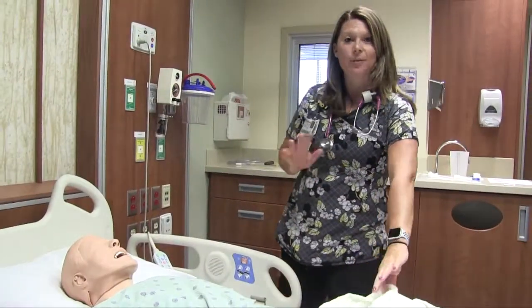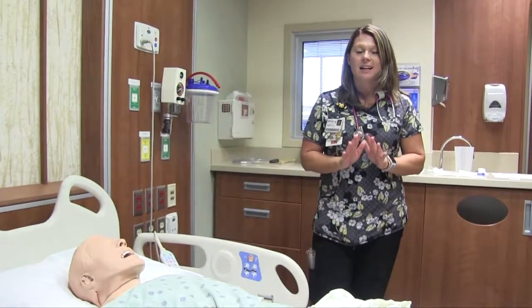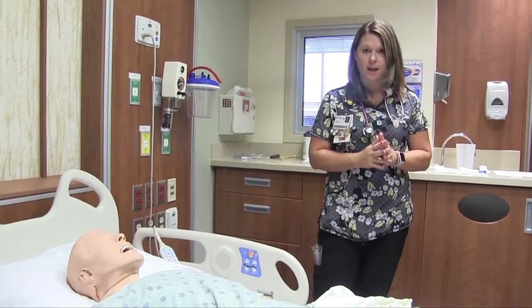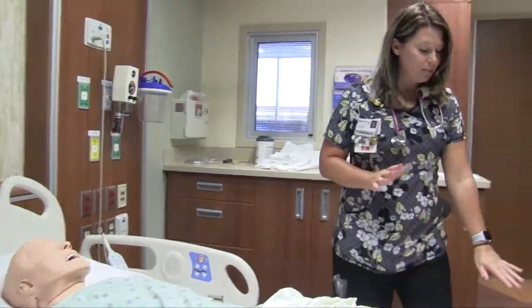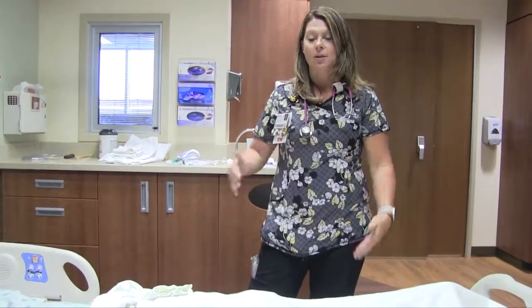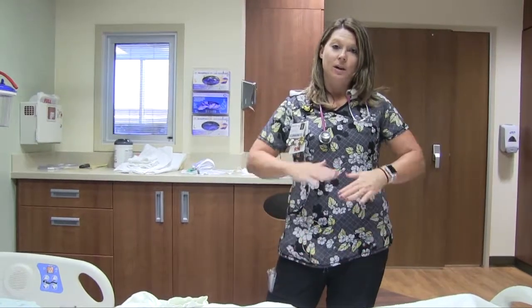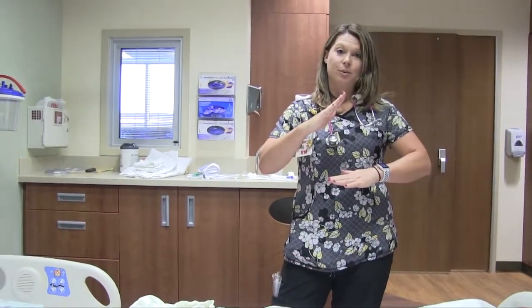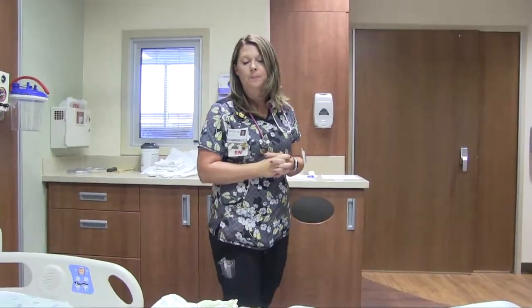Okay, now that we have gone over how to take care of this catheter, I just want to tell you some general guidelines to kind of help you through this process. One of the things you need to make sure, again, it's really important that the bag of your catheter is always below your bladder. It all works by gravity, so if your bag is up higher than your bladder, the urine's not going to flow out, which can cause some issues for you.